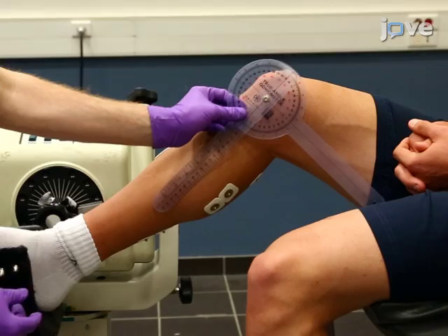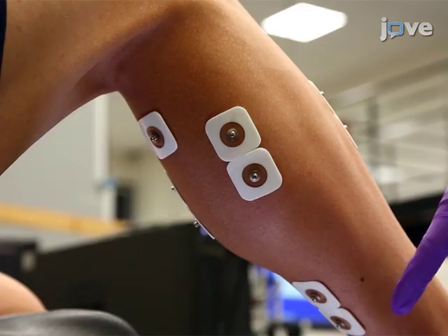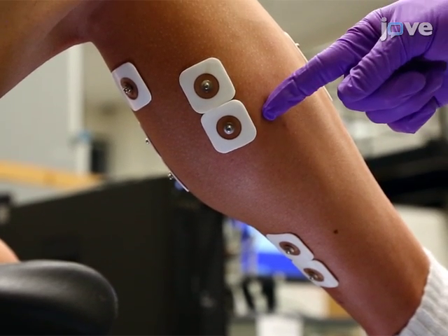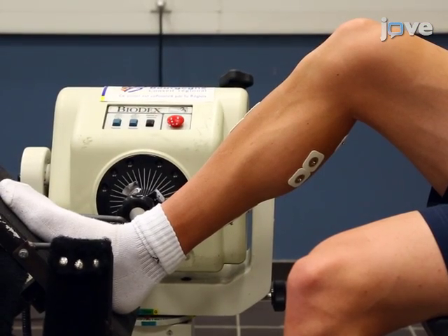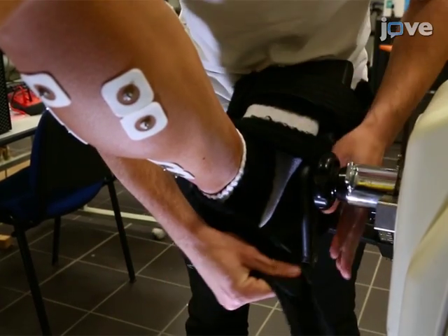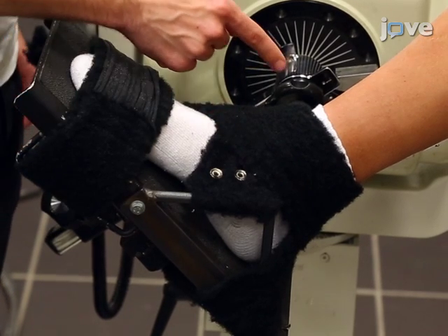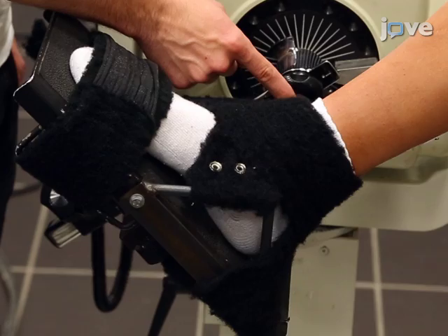Adjust the participant's chair so that the ankle and knee are bent at 90 degrees, so that the soleus and gastrocnemius muscles are not stretched, and so the H-reflex is not altered. Firmly strap the ankle to the ergometer such that the anatomical axis of the joint, which is the external malleolus, is aligned with the ergometer's axis of rotation.